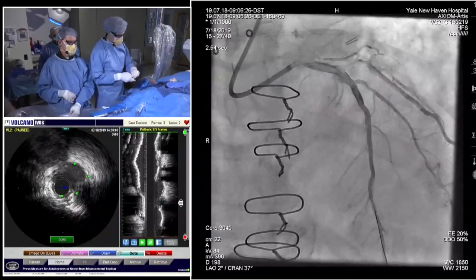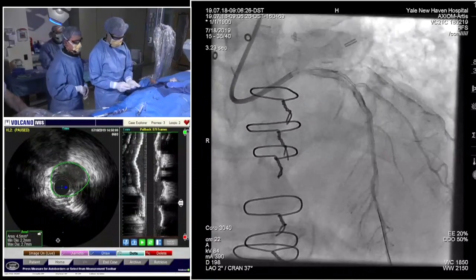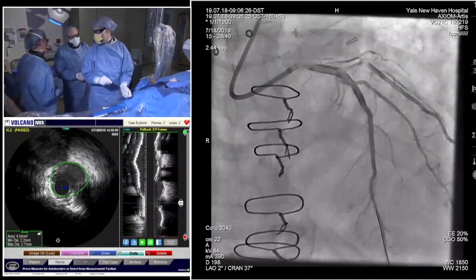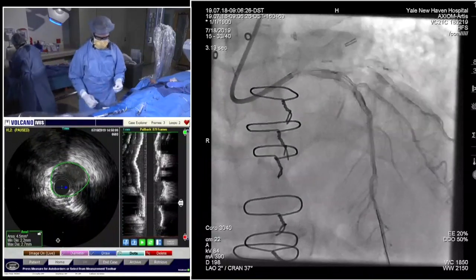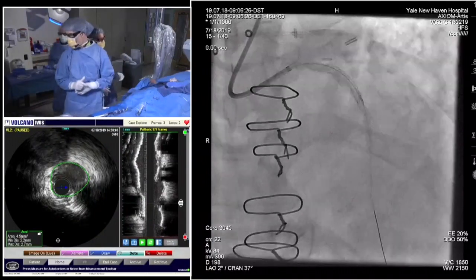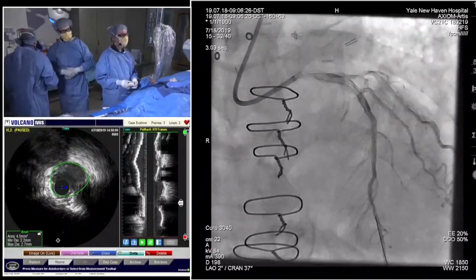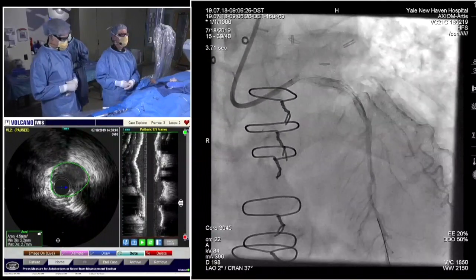But you might want to post-dilate it first, because when you're through that much tortuosity and calcification, if your IVUS butts up against things, then you run the risk of distortion of the stent platform. So maybe NC first, re-IVUS, and you may be good. It's just an asymmetric calcific shelf there, which is why angiographically it looks funny. But instead of taking multiple views to sort it out, you can definitively know by the IVUS.